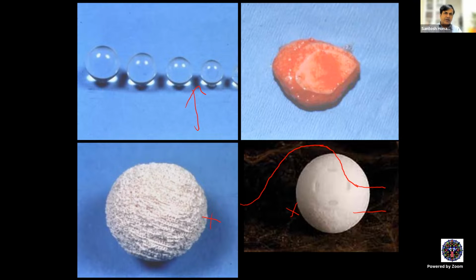For everybody else, and for patients with intraocular tumors and children, we use this. So the standard of care currently is a non-integrated silicone or PMMA implant for children and adults with intraocular tumors. The reason being, why should you use these implants in children or adults with intraocular tumors?